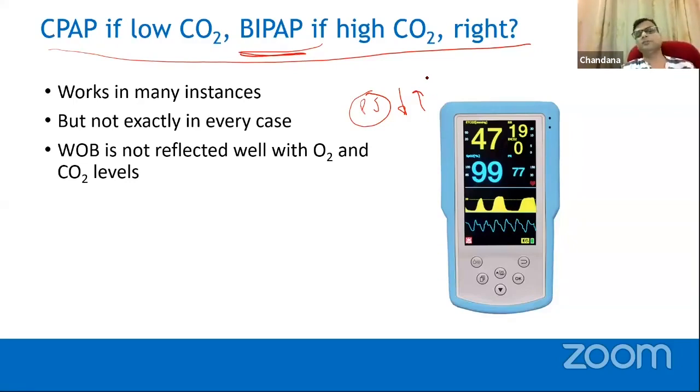But basically nowadays, that theory is no longer 100% valid because there are no widely available ventilators. You may need to continue in NIV for a prolonged duration as long as you get a bed. But always look at the patient. Look at whether the patient's mask interface is good, whether they have proper mask fit, and select the proper mask. Explain to the patient, extremely important, about the consequences of not maintaining the mask and the importance of keeping the mask on and cooperating with the machine.